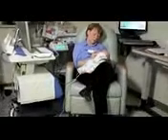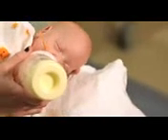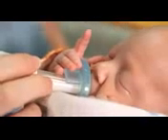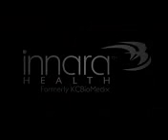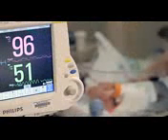When a baby is a patient in the newborn ICU, they are most commonly unable to orally feed due to their illness. When they are able to orally feed, this takes practice and is commonly a difficult skill to acquire. The NTrainer is a tool that we can use to help babies acquire that skill. We designed the NTrainer to assess every patient's non-nutritive suck response and provide therapy to those patients who require additional entrainment to improve their non-nutritive suck response.